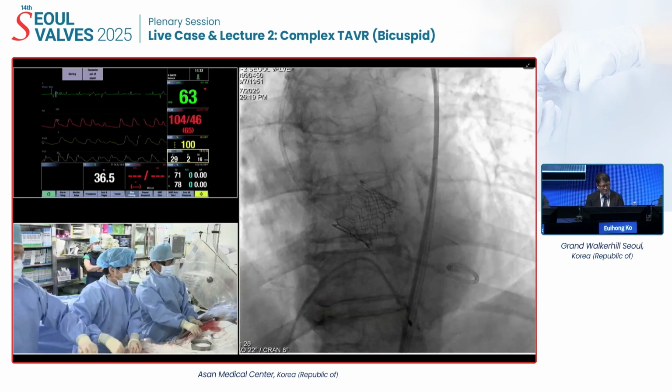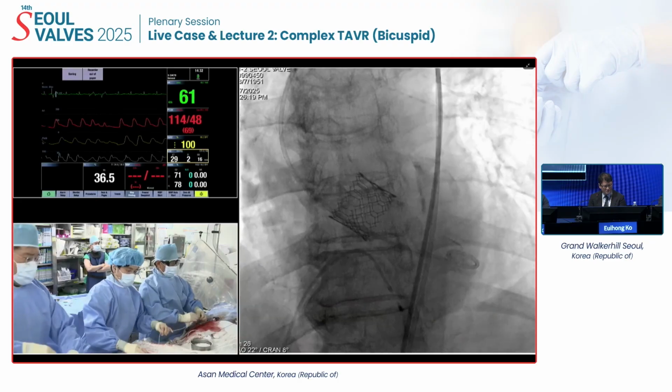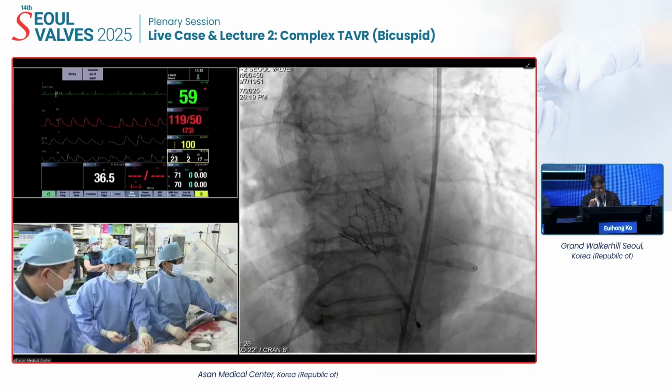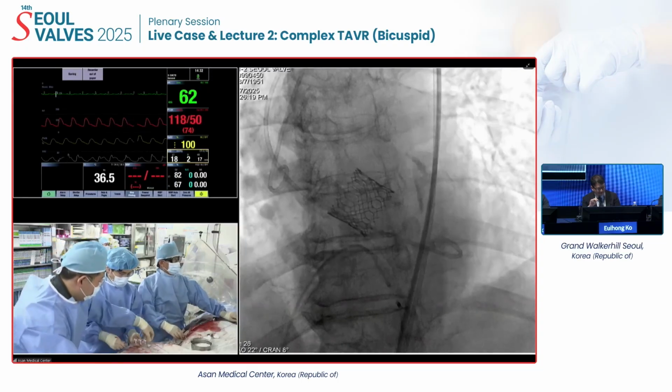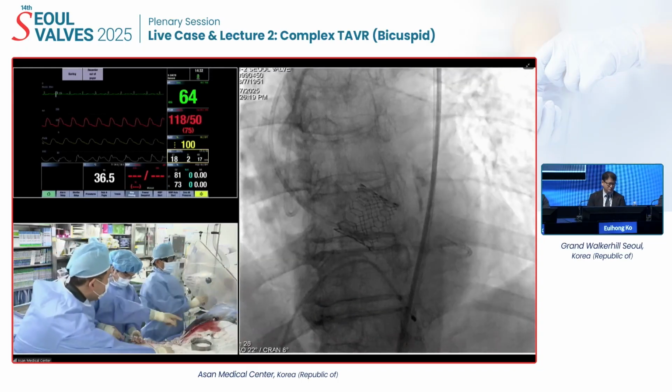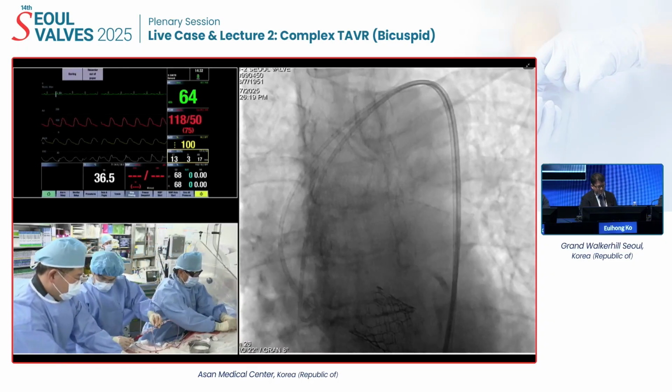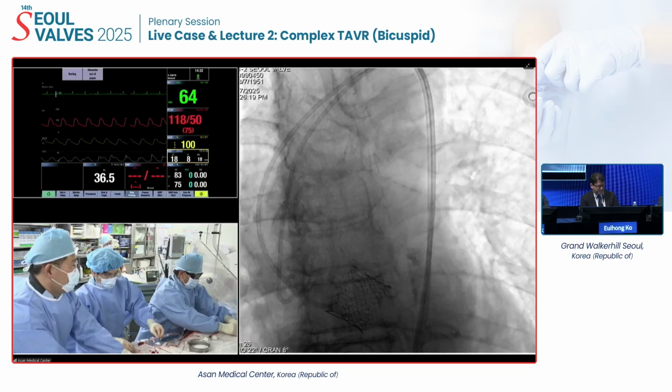More than 1,000, we consider it a very calcified aortic valve disease. I think that volume is measured by the 850 threshold, right? Yeah, usually 850. The software automatically provides the calcium volume. Thank you.